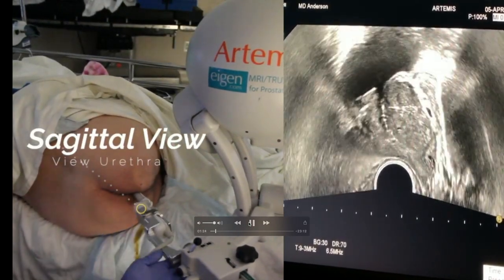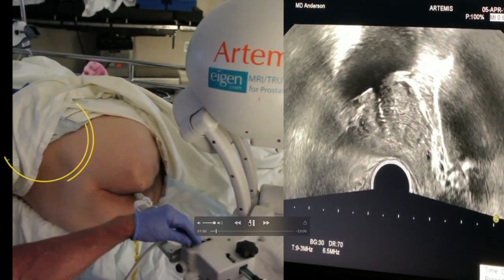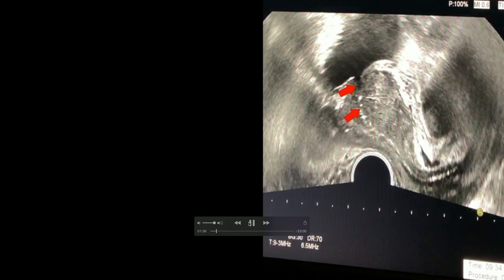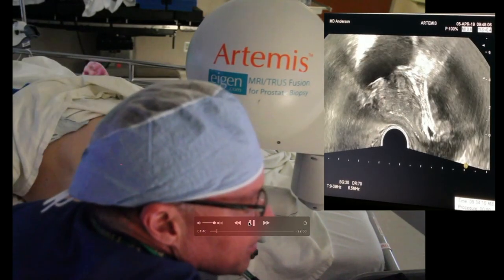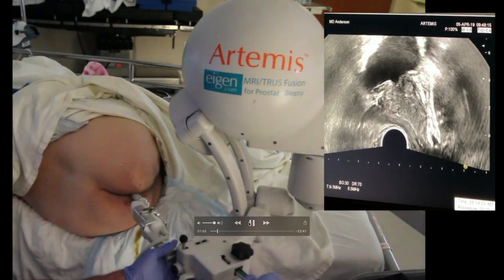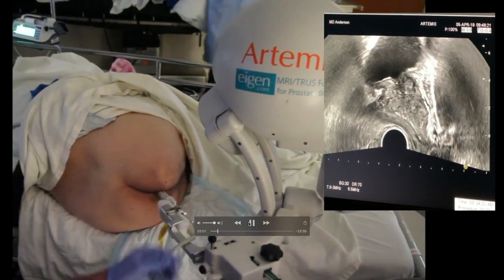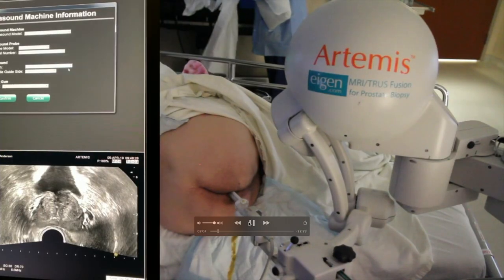After you've got it in the proper position in the transverse view, I turn it to the sagittal view so that I can see the entire urethra throughout the prostate. Here's an image of the entire urethra in the sagittal view. Once I know I can see the entire urethra, I know I have it in the proper plane from left to right. I then adjust it using one of the mechanical arms so that it's in the exact middle of the prostate between the base and the apex. You can adjust the pressure you're putting on the prostate so that you might marry up better with your MRI.